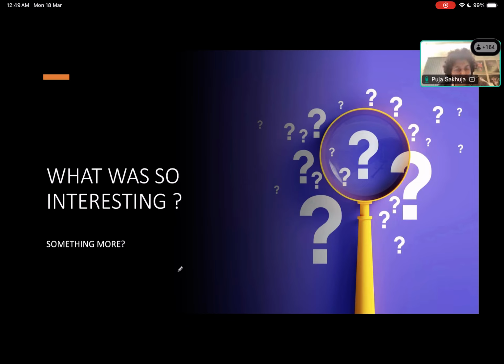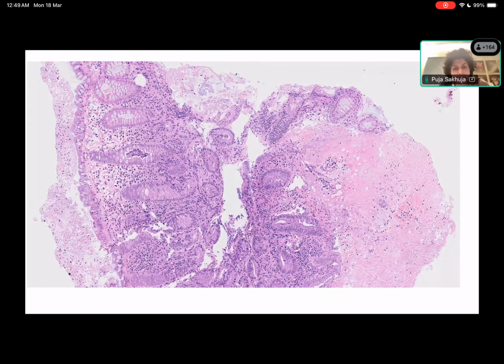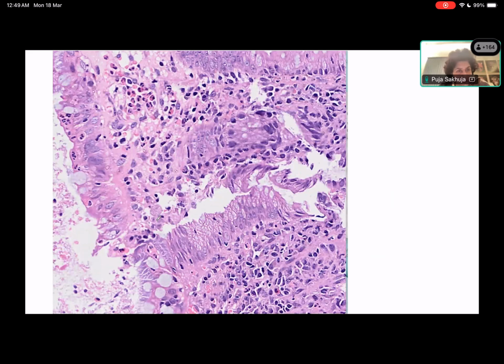Amoeba, most of you should have seen by now, so that was not the reason. Anything else? Should we go back to the video once and see if you can find something else? If it plays. I will not play it now. Okay, so then we'll just go to the pictures that I have taken. Even in this, you can see. But anyway, now what is happening here? That's not the interesting part. This is just a regular question.